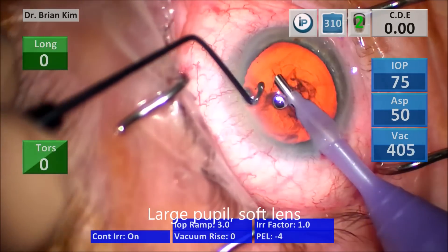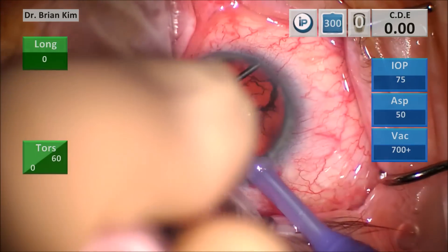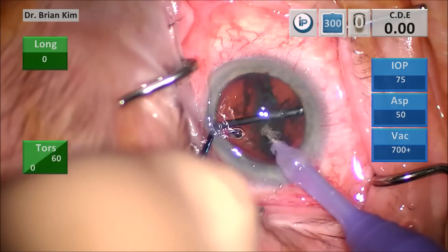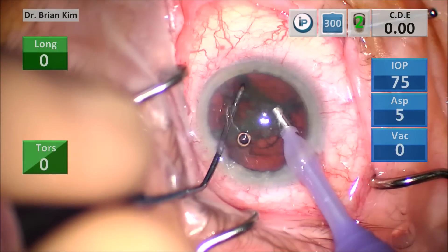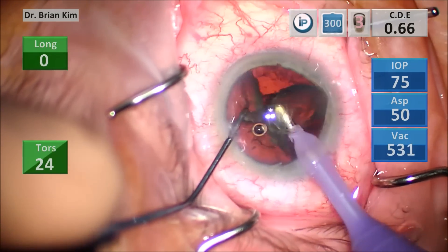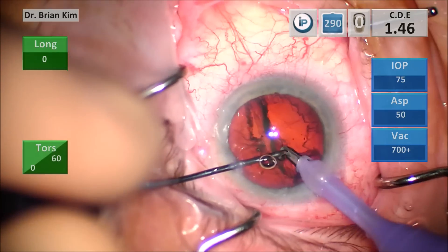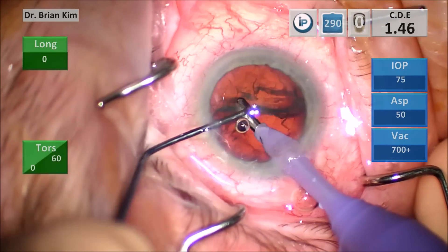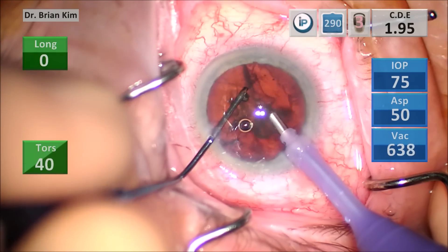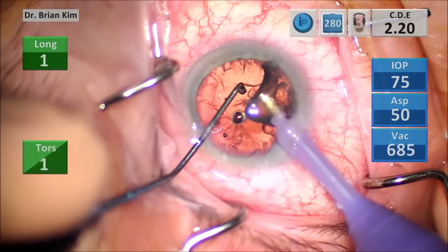This first case is a large pupil in a soft lens. I routinely remove the epinucleus, but this is not essential. I'm sliding the chopper under the anterior capsule and doing the same thing with the FacoTip, moving the two pieces together and breaking. Doing the same thing with the right hemi nucleus and chopping in the same fashion. The main mechanism of action is drawing that chopper under the anterior capsule and around the equator, and using the FacoTip simply as a mechanical counter force to initiate the chop. During my chops — please pay attention to the FacoDynamic overlay — I have position zero every time I initiate a chop. The only time it's a position other than zero is when I'm actually emulsifying and removing the pieces.